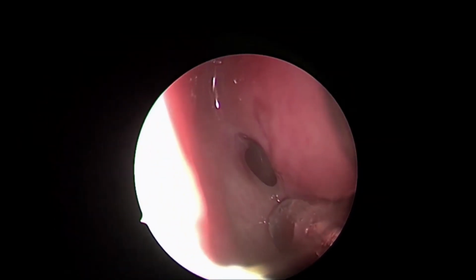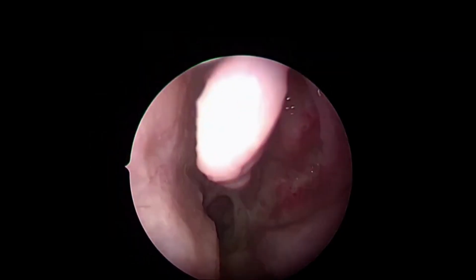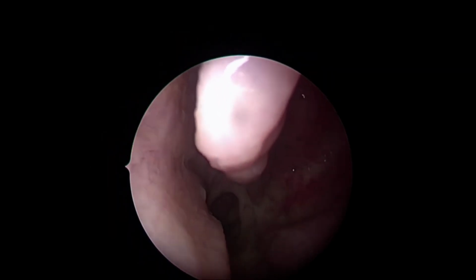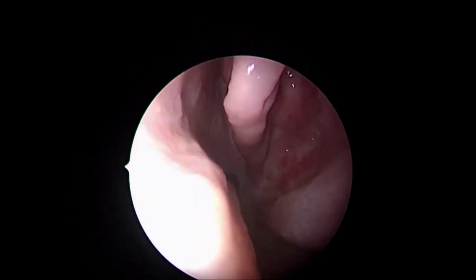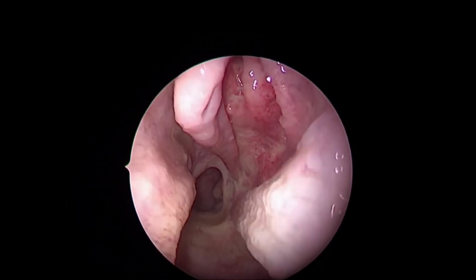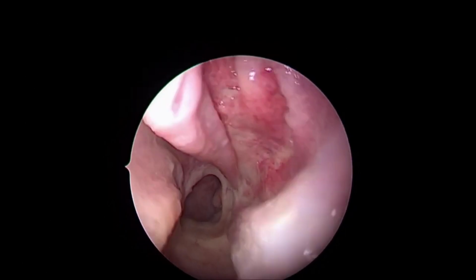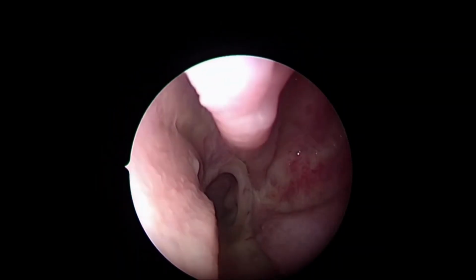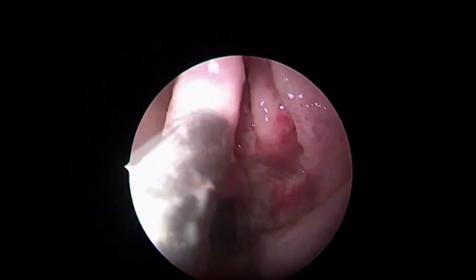We all know the sphenoid bone, which is centered in the center part of the skull, is so complex a bone and has an amazing relationship with the surrounding neurovascular structures. The science of skull-base surgery stands on this fact that this particular bone is pneumatized. And that gives us space to address the surrounding neurovascular structures directly, without mobilizing the cerebral and other structures, and we can address them directly through this pneumatized space. And that is the basis of endoscopic skull-base surgery. So we'll move on to the skull base later.